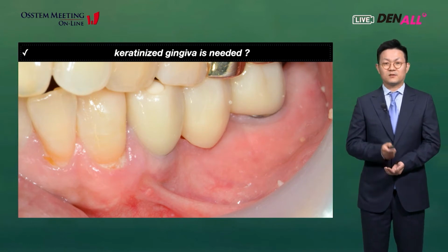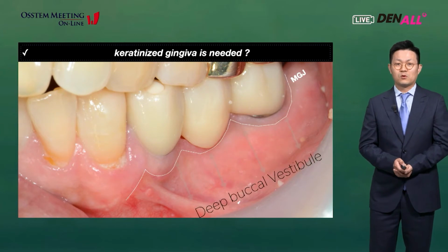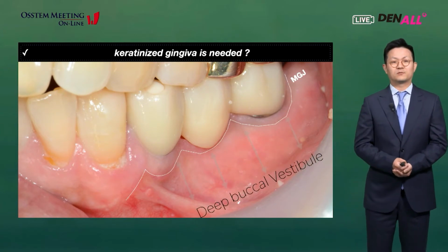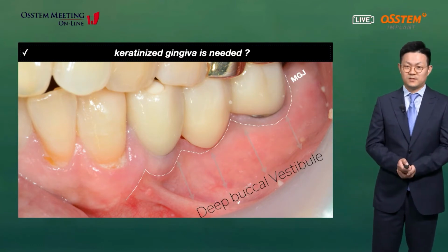And how about this case? Even though attached gingiva is missing, this patient has a deep vestibule, so we cannot find any sign of inflammation of the soft tissue around the implant. I think it's an acceptable situation.